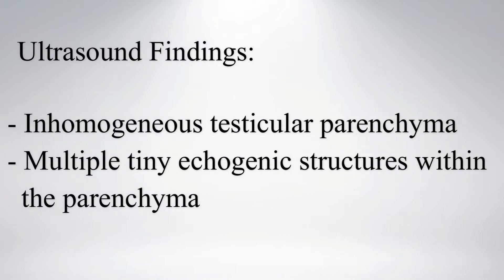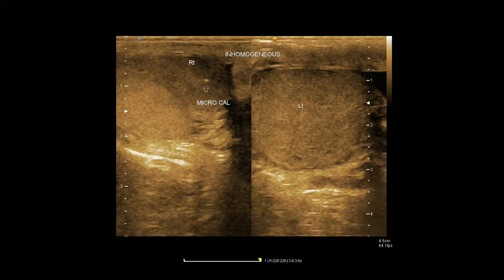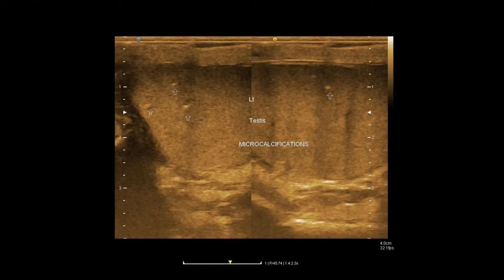On ultrasound, multiple tiny echogenic structures are noted within the inhomogeneous testicular parenchyma. This image shows inhomogeneously hypoechoic testis; compare the echogenicity bilaterally. This hypoechogenicity is due to inflammation. Tiny echogenic calcific foci are also noted.